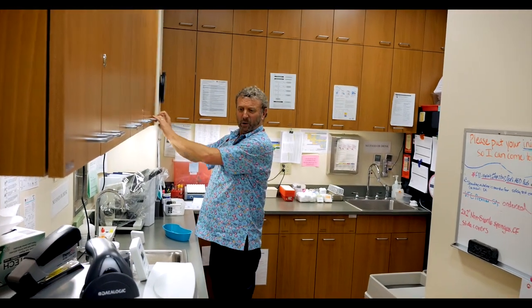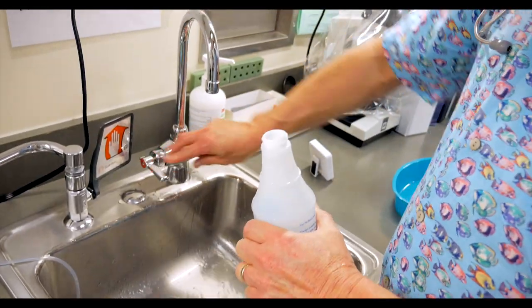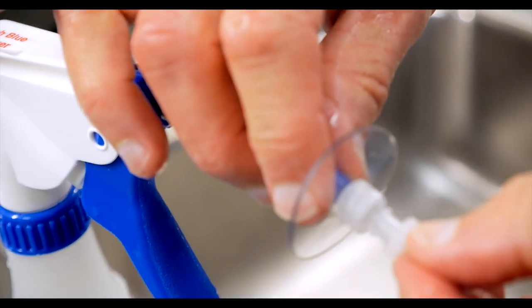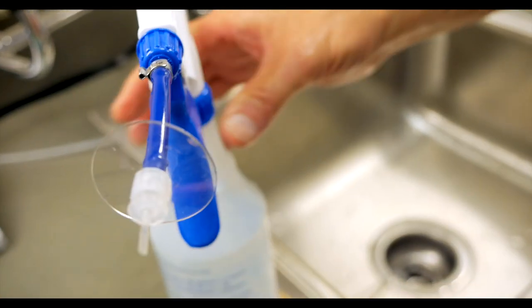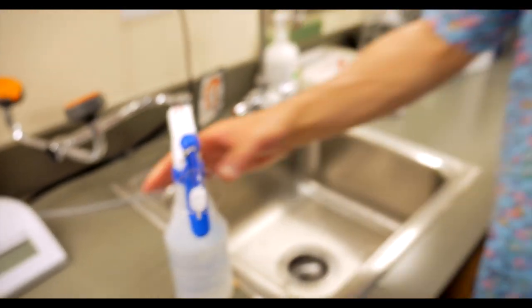What are you doing? I'm getting my equipment to flush an ear. We want to have warm water — not hot, not cold, just right. Sometimes I'll add hydrogen peroxide, but I've already peeked and this wax is just sort of goopy. I think it'll flush right out with warm water. We've got a little shield so the water that splashes back doesn't hit me, and then there's a little plastic tip that will direct the water into the ear.